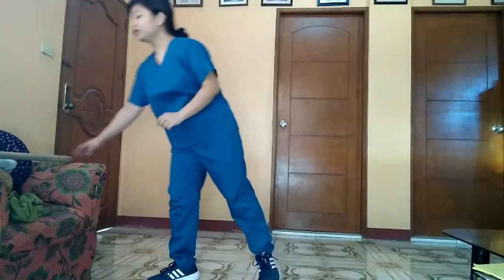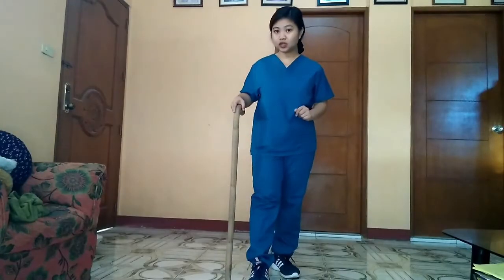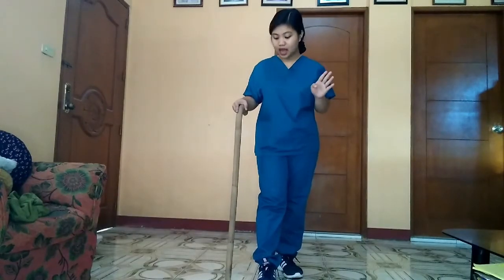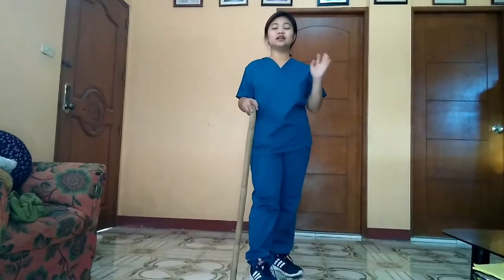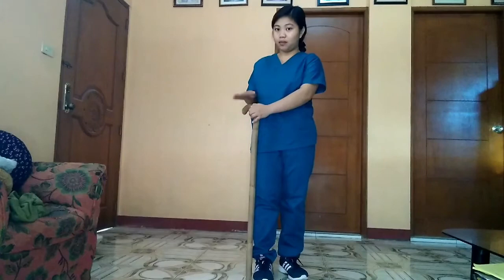The first assistive device that we are going to use is the cane. We have the improvised cane here, and then first, help the patient to walk with the use of the cane. Make sure your patient holds the top of the cane beside the stronger leg. For the proper fit of the cane, make sure the foot of your patient is at least 4 inches away from the tip of the cane, and then the elbow is bent at a 15 to 30 degree angle, and then make sure the wrist crease of your patient is level with the top of the cane.